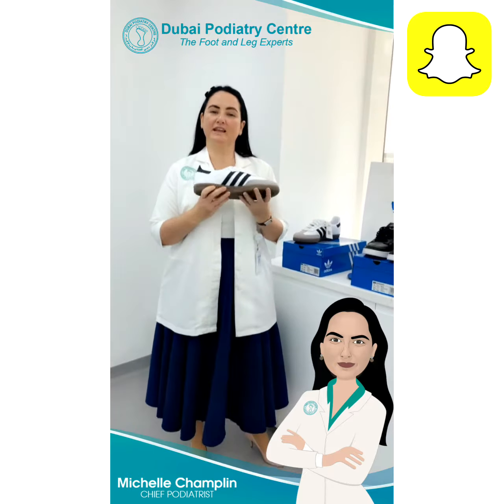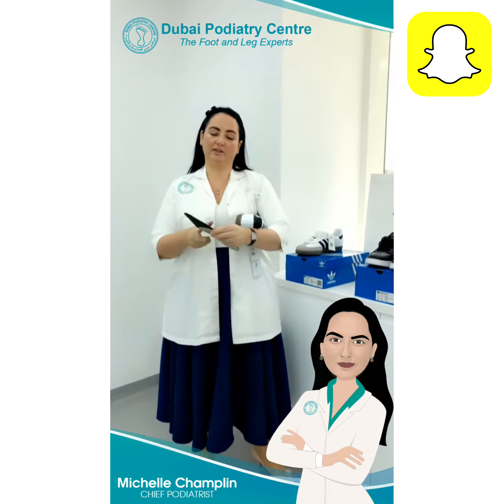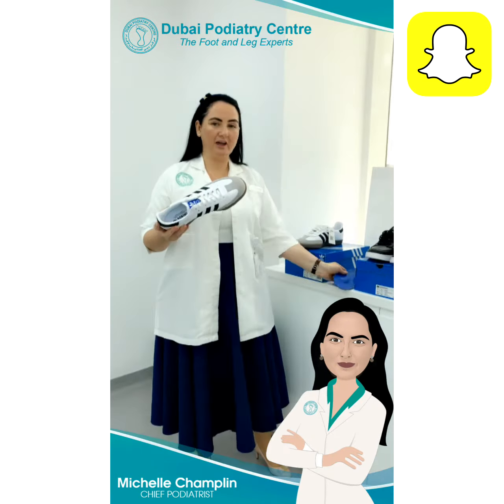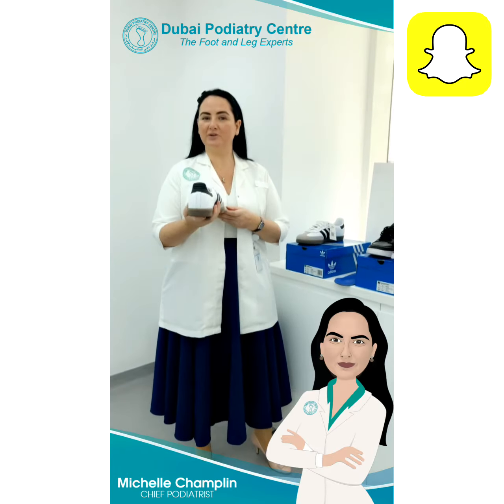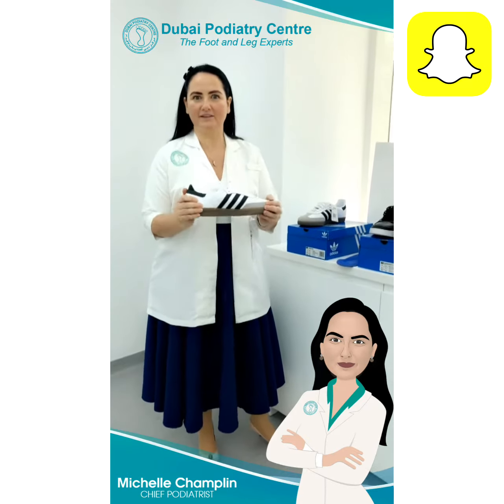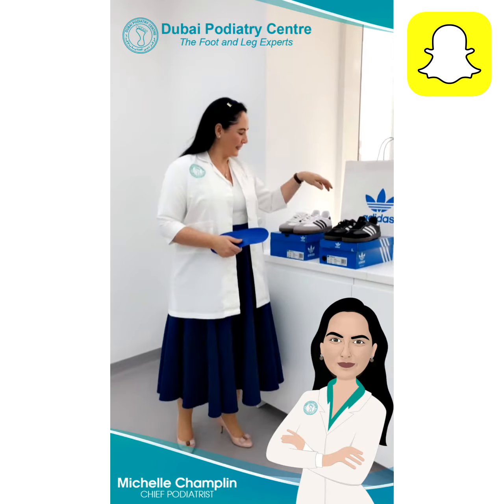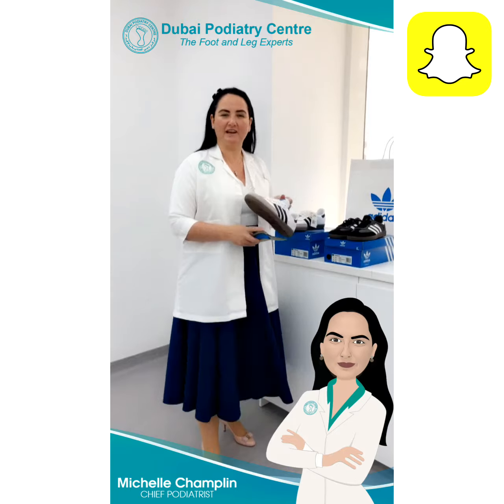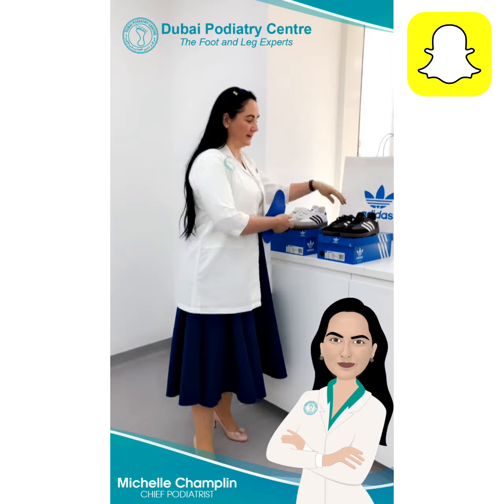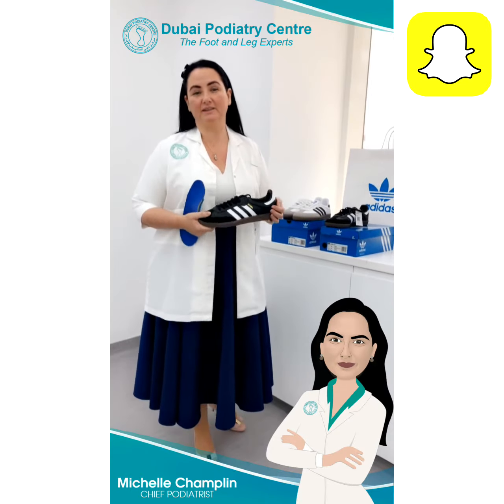These are Adidas Sambas, and the reason we like these is because they have a really firm sole. If we're putting a tilted orthotic — for example, this person has a 22-degree tilt on their ankle — we need a really strong-soled shoe to accommodate the tilt, and the Samba is perfect for that. For our Emirati patients who wear kandora and sometimes prefer not to wear white, the Samba also comes in black, which looks great with the kandora.